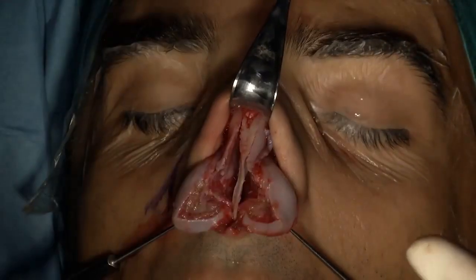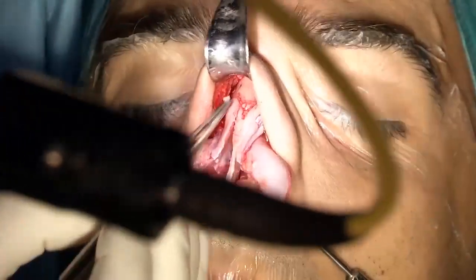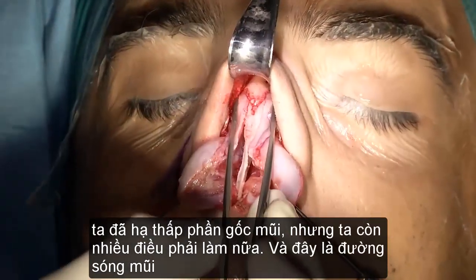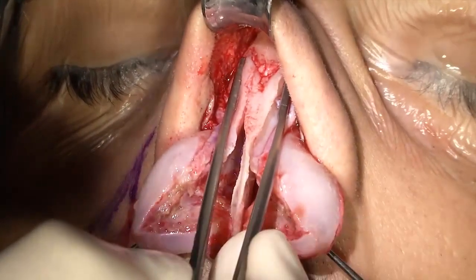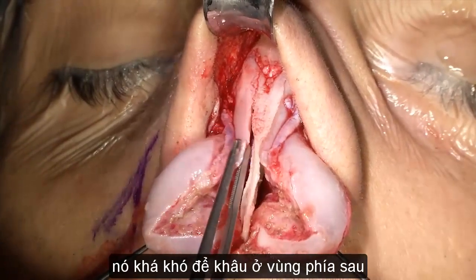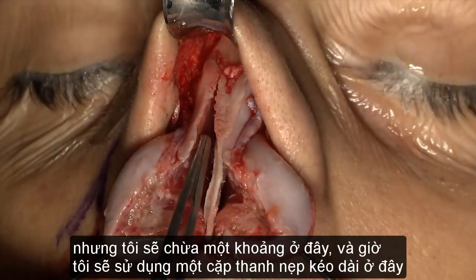So we just did some osteoplasty. We lowered the radix. We have these things jutting out. We have to do something about them. And these are the dorsal lines. So it's almost a matter of suturing back, but I will need a little spacer here.